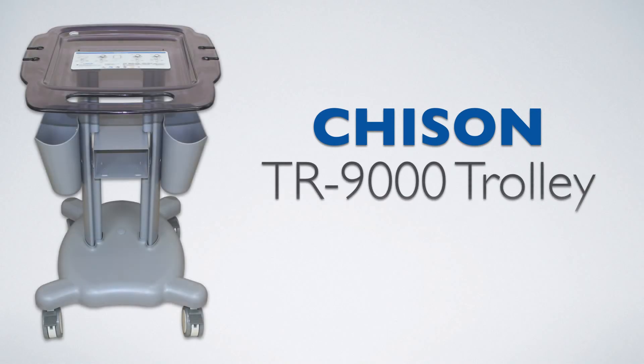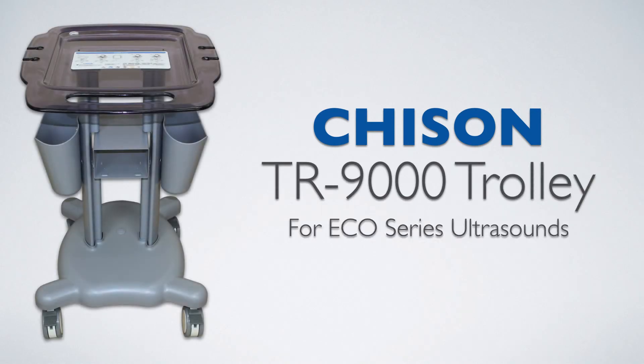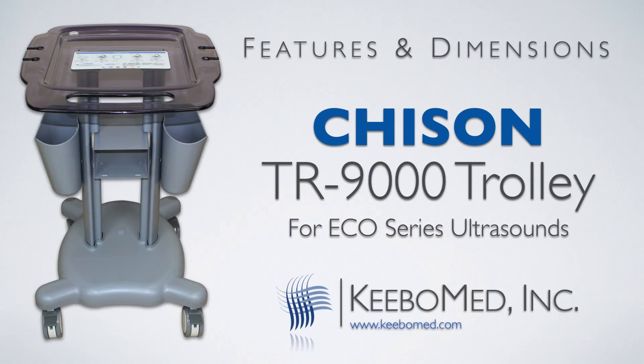Visit Kibomed.com today to purchase the TR9000 Ultrasound Trolley Cart.